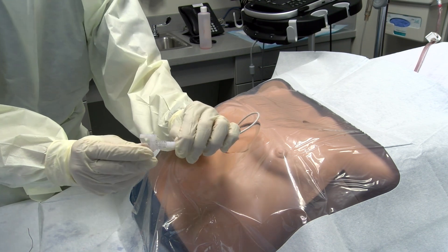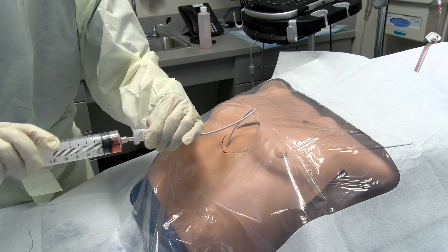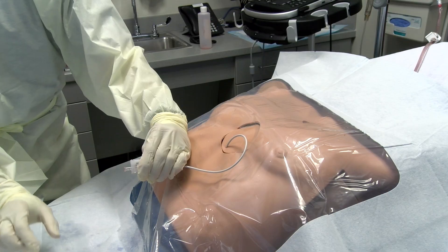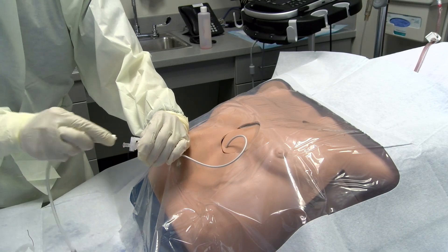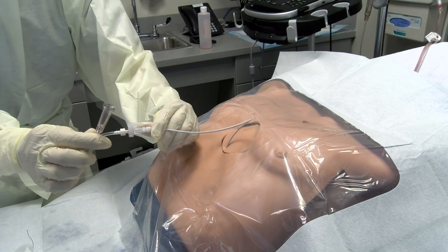Initial drainage of even a few mLs of fluid may improve the hemodynamics if the patient has pericardial tamponade. The stopcock can be connected to a gravity drain or assisted with manual withdrawal of fluid by using the syringe.